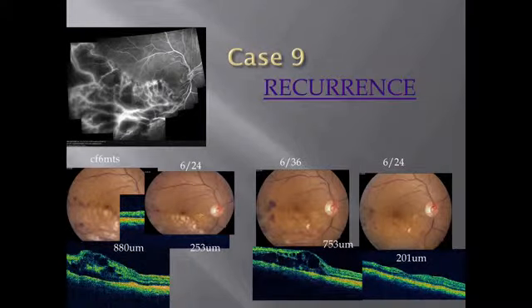So this is a patient where there's already an Ozurdex injected inside. With the recurrence, this is a second injection that you've made, and then you're also lasering them at some point. The same goes for BRVOs, where you see recurrences, and those we would put on a mild sectoral laser at some point, grid laser, so that the recurrence rates or the re-injection rate becomes less. Most of these patients we either treat with 3 injections of anti-VEGF and then follow them up depending on if they require more, or give Ozurdex.